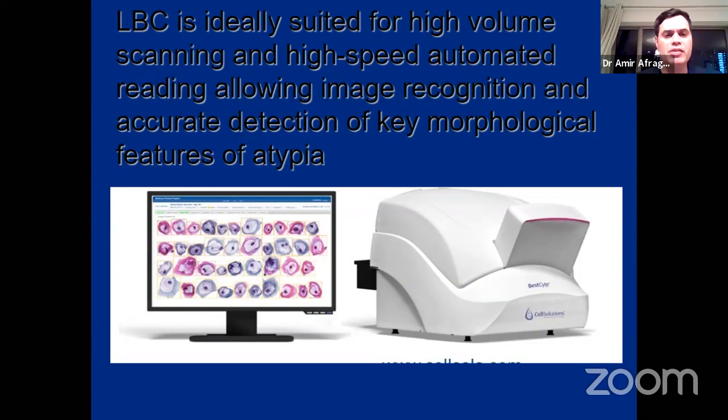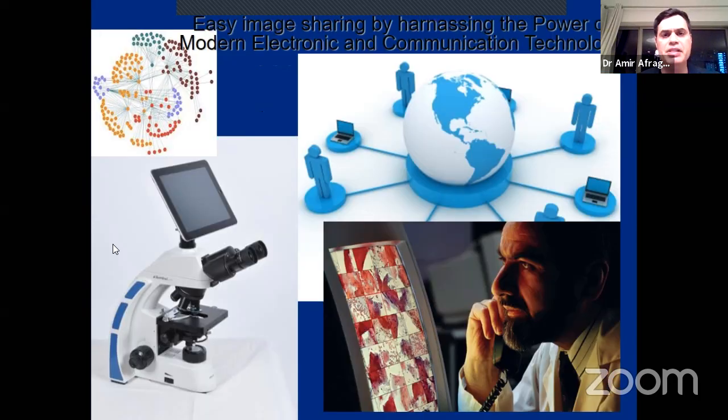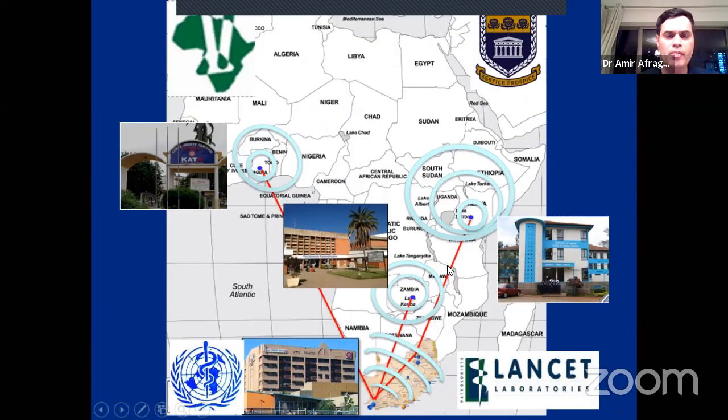Also with liquid-based cytology, what is very nice is that the sample that you get and the cells can then be transferred into a computer, and there are some software programs that can pick up your atypical cells. And then these images can be shared with colleagues around the world.